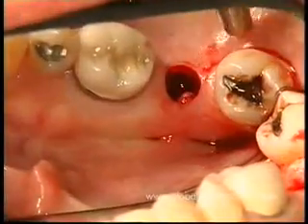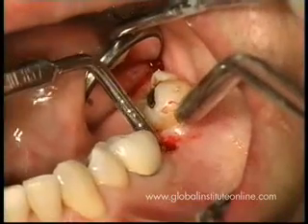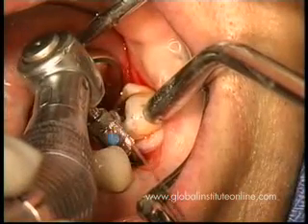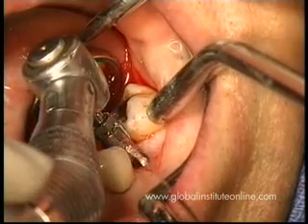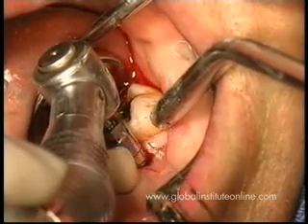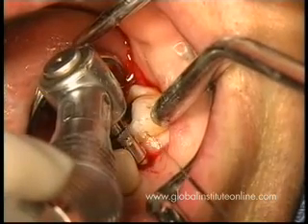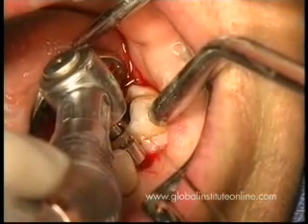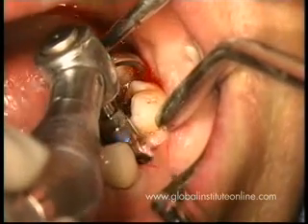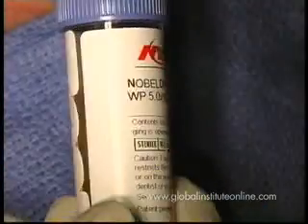Now important is always to evaluate the density of bone. So in this particular case, we're evaluating this here and have concluded that the bone density is probably quality 1 or 2 in this male patient with a posterior mandibular indication. So a screw tap is being utilized to the full depth of 10 millimeters to prepare this site to receive the implant. And this is a decision which is made by the clinician.